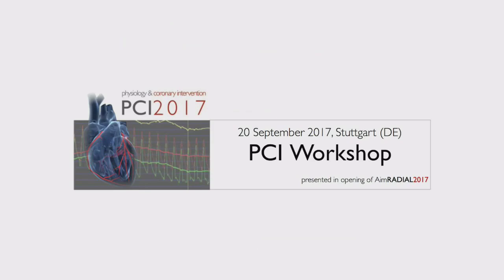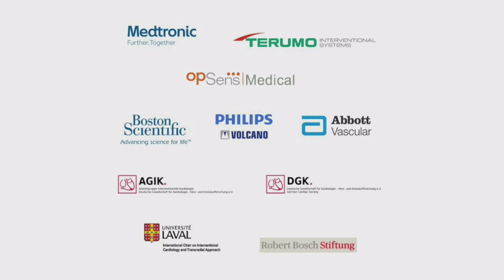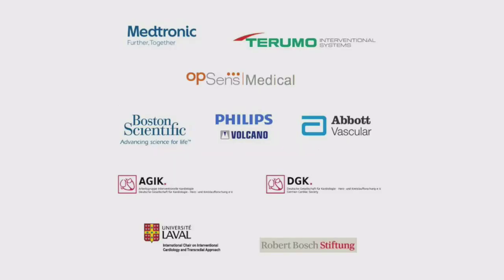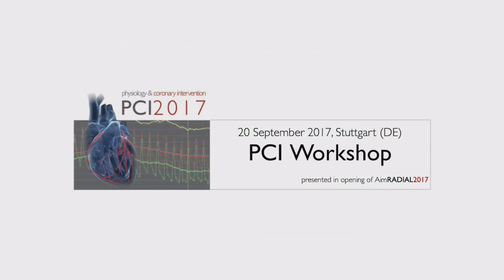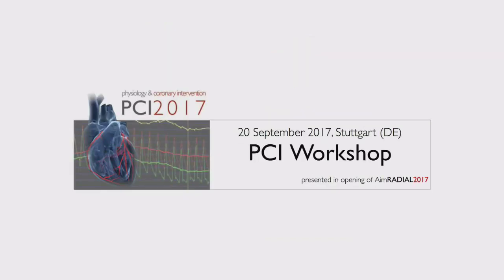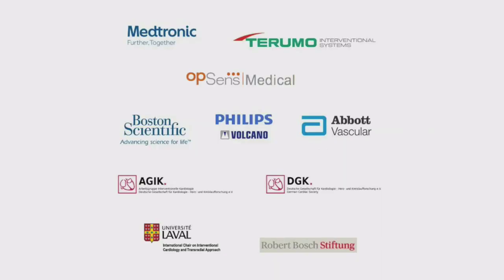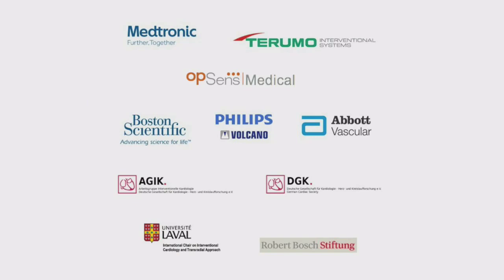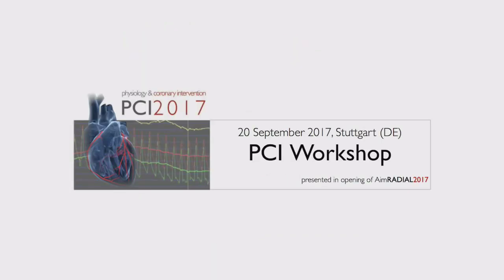But I have a question, I'm sorry, just to add to the discussion. How often are the results you get with the post-PCI FFR really actionable? If you look at some data, there is a group in Arkansas which have been quite active recently. Sometimes I disagree with the data, but they still continue to claim that in between 10 and 15% of the cases, they will do more on the PCI technique and stent deployment, using the imaging. So I think we are going to learn more from the Rotterdam trial, where they still use the imaging to see how often you can improve the result.